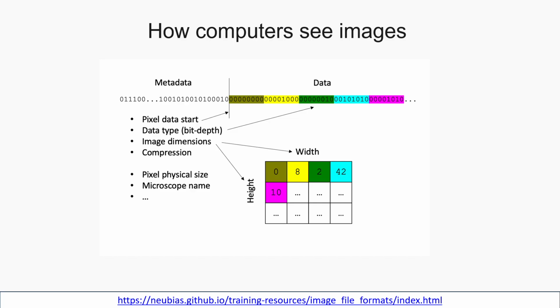When we look at an image, we see cells, tissues, and biological structures. A computer sees something very different. Internally, an image is simply a collection of numerical values arranged in a structured grid. Each pixel location stores one or more values depending on the image type. Software interprets these numbers and converts them into images we view on the screen. Remember that image analysis software ultimately operates on these numerical values rather than on the visual representation itself.